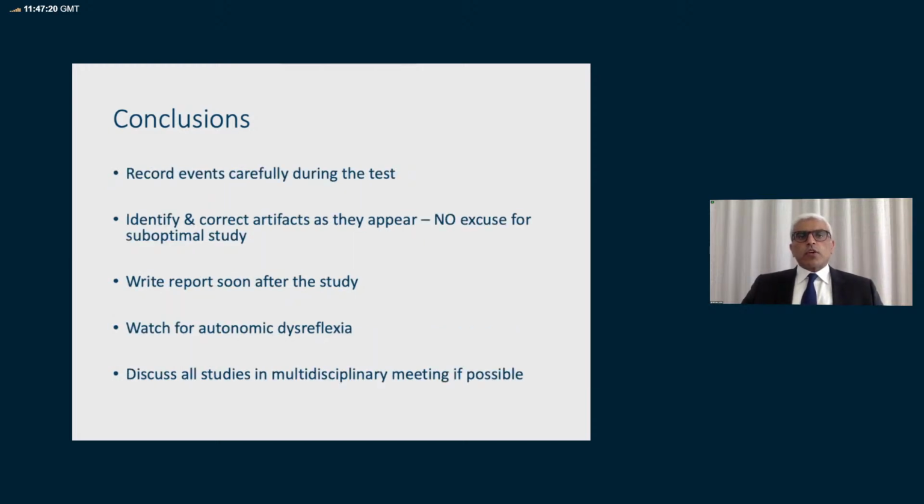Going through the test, record the events carefully during the test. It's a dynamic test, so one should record as the test is going on. If any artifacts appear, the test should be stopped and the artifacts should be cleared. Please don't proceed with doing a suboptimal study.